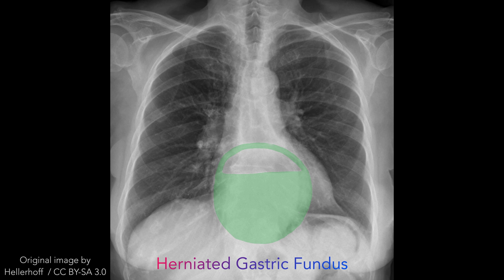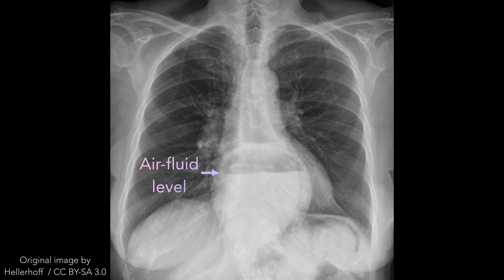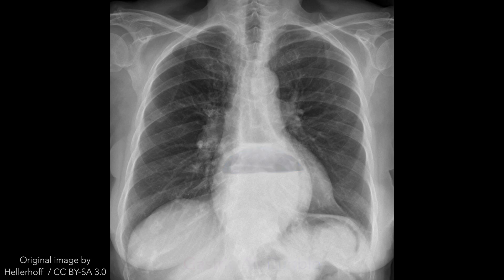Hiatal hernia usually presents radiographically as a well-defined, rounded, retrocardiac opacity with an air-fluid level. In many cases of hiatal hernia, there will not be an air bubble below the left hemi-diaphragm. This is a relatively expected finding, considering that the stomach is no longer in its usual position.